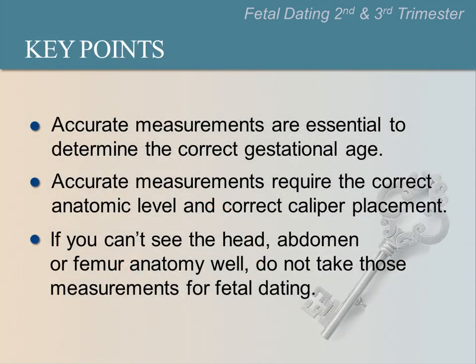Let's review the key points. Accurate measurements are essential to determine the correct gestational age. Accurate measurements require the correct anatomic level and correct caliper placement. If you can't see the head, abdomen, or femur anatomy well, do not take those measurements for fetal dating.